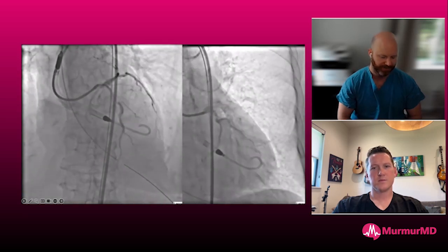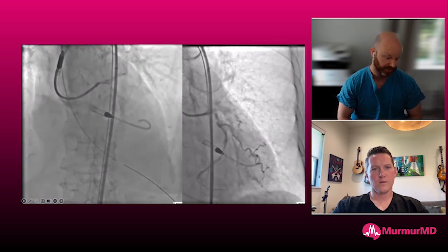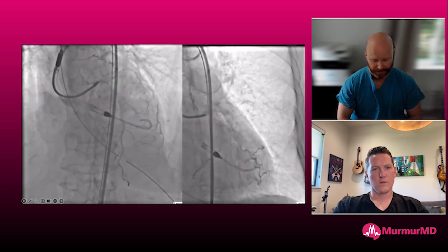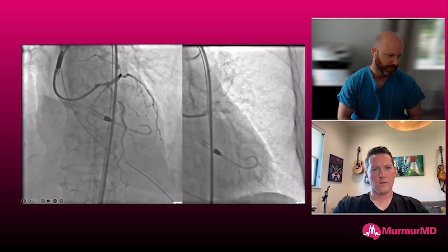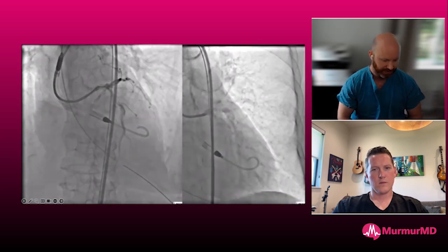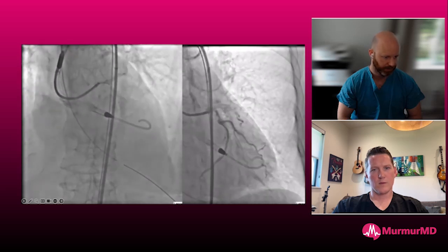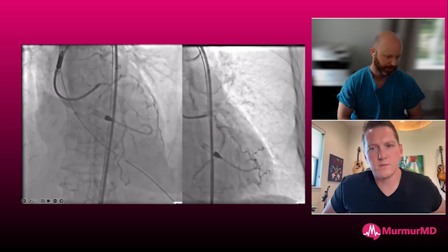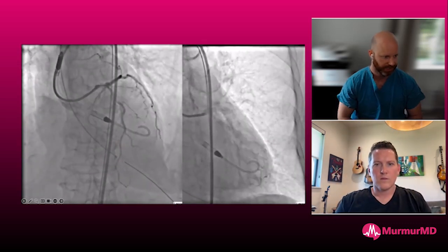Got it. We can obviously revascularize the left, and in a handful of cases, we have actually done that to prepare for catastrophe if we needed to. But generally speaking, I just use the same side now. As you mentioned, we've revascularized it to the point where we could implant easily a 14, 16, 17 if we had to, ECMO cannula. And so we feel like we're in an adequate position from a bailout hemodynamically, and from a balloon tamponade or other standpoint, we can easily deliver equipment now because we've modified it.